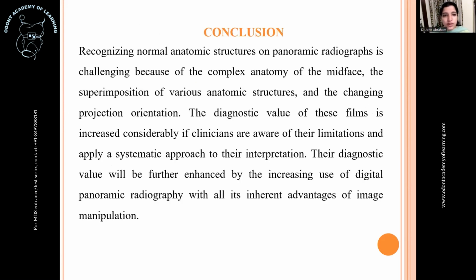Coming to the conclusion, recognizing normal anatomical structures on a panoramic radiograph is challenging because of the complex anatomy of the midface, the superimposition of various anatomic structures, and the changing position and orientation. The diagnostic value of these films increases considerably if clinicians are aware of the limitations and apply a systematic approach to interpretation. Basic knowledge of the normal anatomical landmarks is very necessary to interpret pathology.